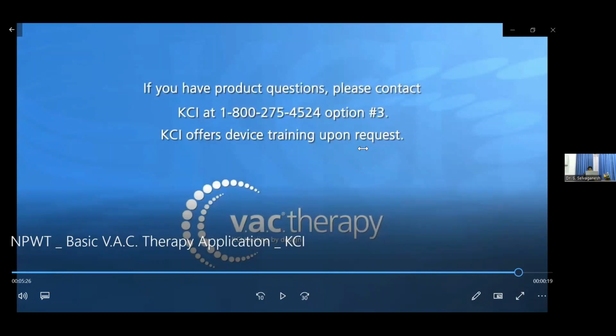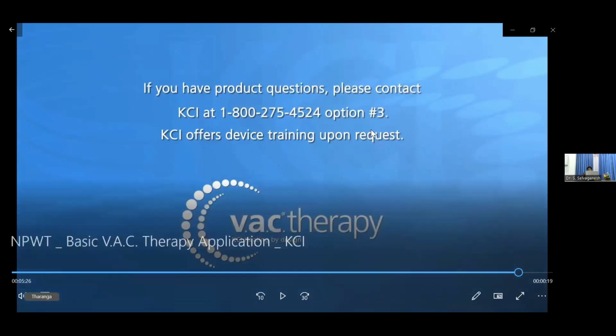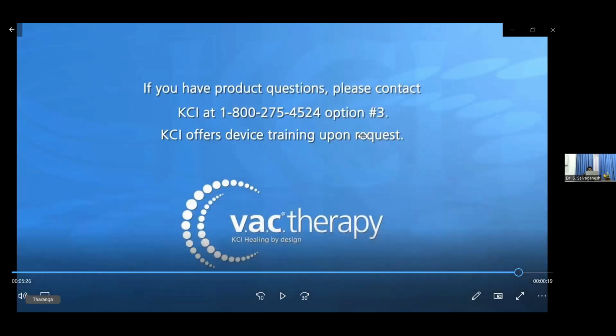Is this causing pain for the patient? When the negative pressure is applied, it gives a bit of counter pressure. The foam gives pressure to the wound surface, but it is not unbearable. We can manage it with analgesia. So I can't say there is no pain, but the advantages are more than the pain.